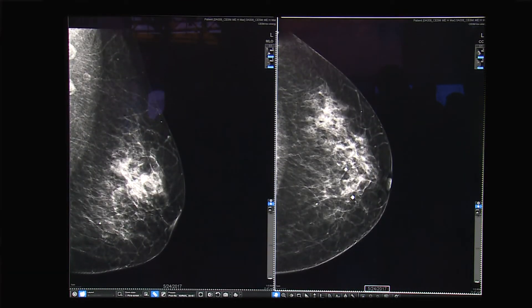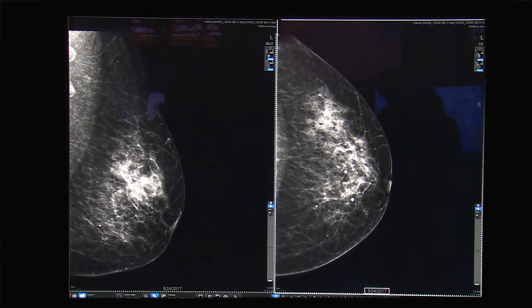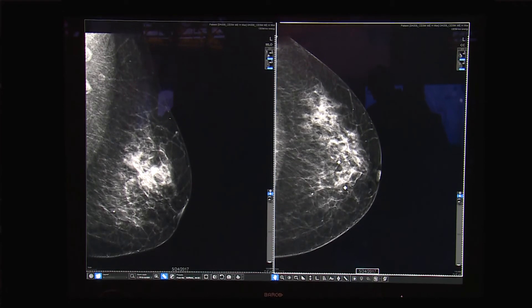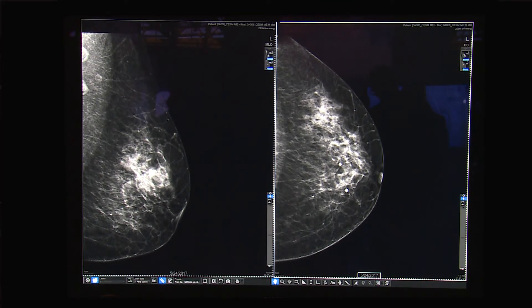Most recently on the CineGraph Pristina, we now have what is called Cinebrite HD. Cinebrite HD is a contrast-enhanced spectral mammography exam that can be performed on the Pristina. It is very similar to a diagnostic mammogram, but we inject contrast into the patient and then do a routine four-view exam, receiving low energy and recombined studies. This is beneficial for inconclusive mammogram or inconclusive ultrasound cases where the patient needs something additional. The sensitivity and specificity with contrast-enhanced is very similar to MR.